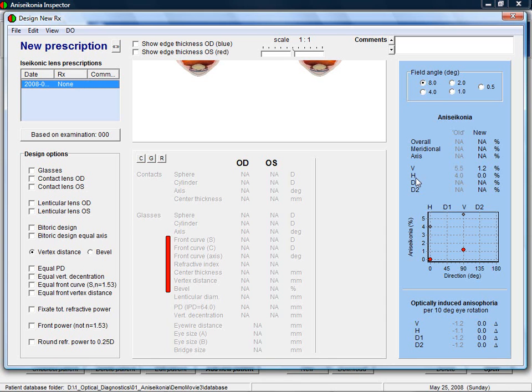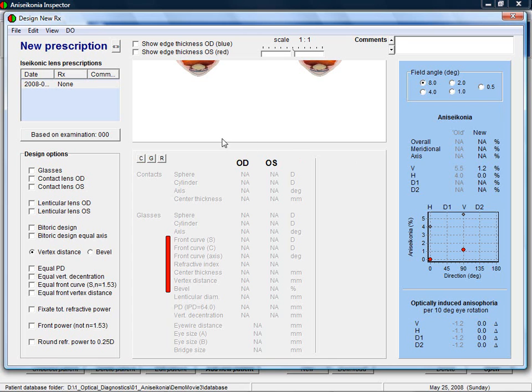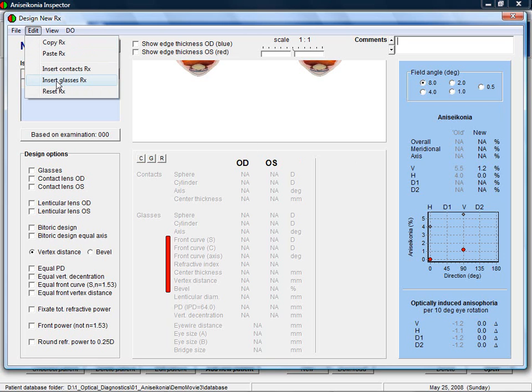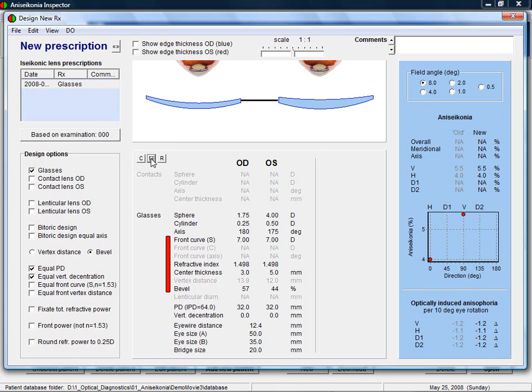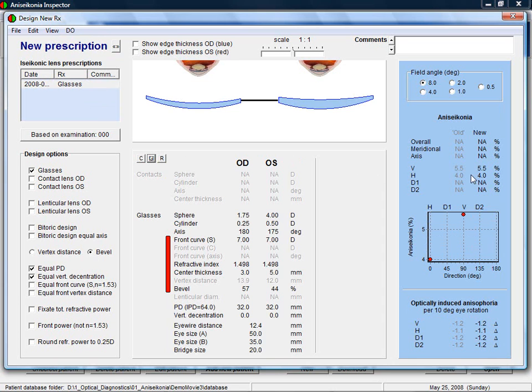When starting a new design, there is an empty new prescription, giving in this case close to 0 aniseikonia values. Of course, an empty prescription is no option, because now the patient is not corrected for refractive errors either. Therefore, we click on Edit, Insert Glasses, or in short, this small button with a G on it. Now, the same prescriptions as was used during the testing is filled in for the new prescription. The calculated aniseikonia for the new prescription is now of course the same as the measured aniseikonia of the old prescription.